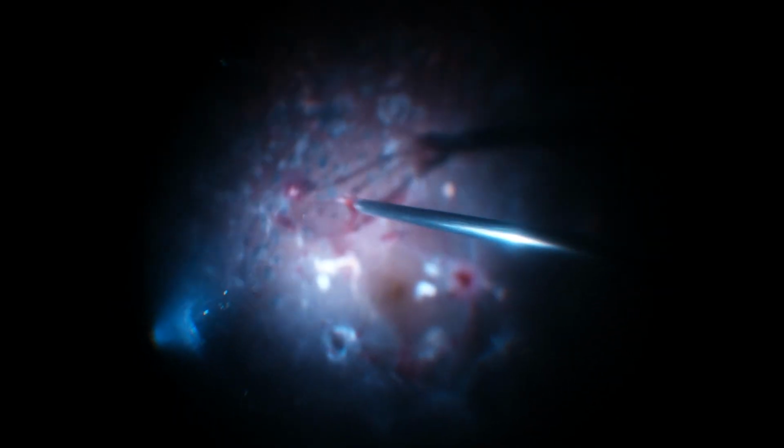The bleeders were further cauterized. The membrane dissection was completed.